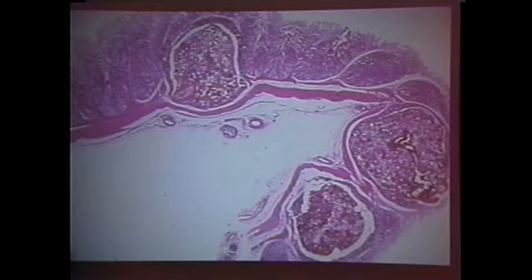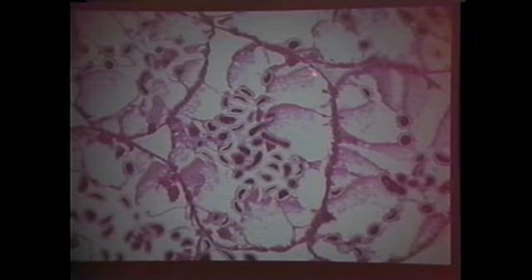And we continue. Tetrameres, it's a spirurid. You look at this thing and you go, look, I can't even make it out as a worm. Well, yeah, you're right. It's hard to make it out as a worm because it becomes such a hypertrophic sac of eggs. But these are all the eggs. It's hard to pick out the intestine and stuff, but if you study it enough, you can. But look, it's spirurid type eggs. It is thick shell, small, oval, contains an embryo. And look, it's the one with those little filaments on it. Okay, so you can use that as well.